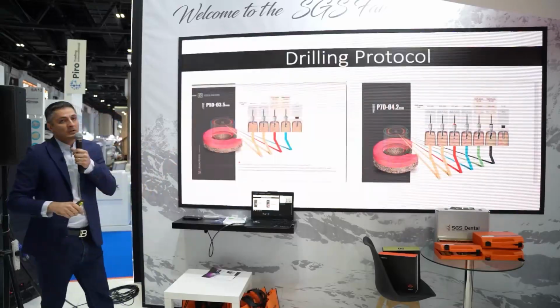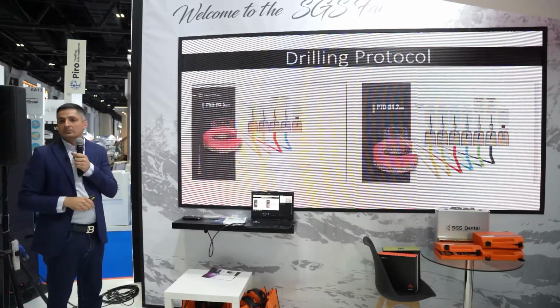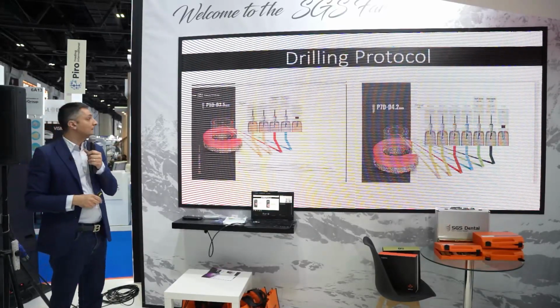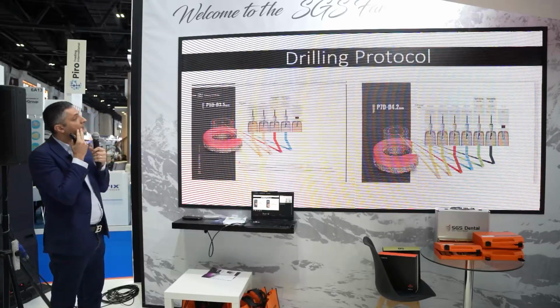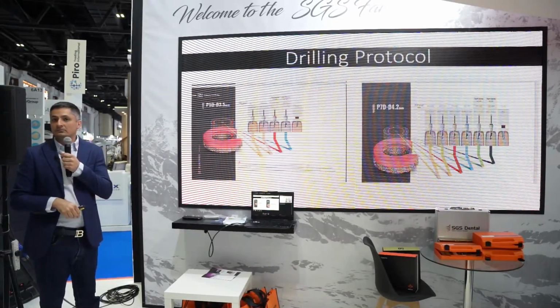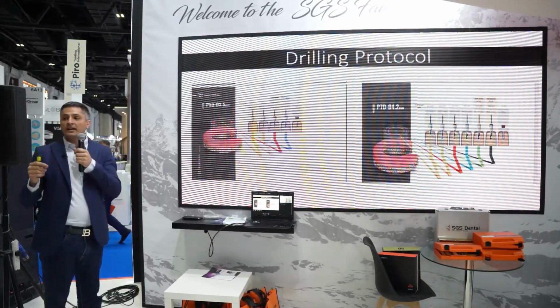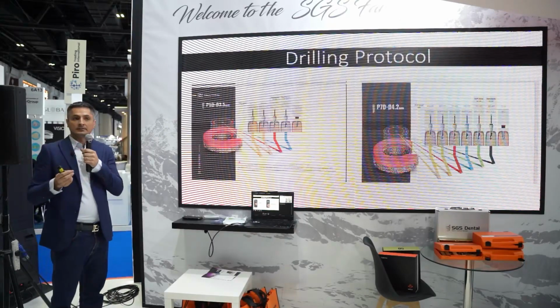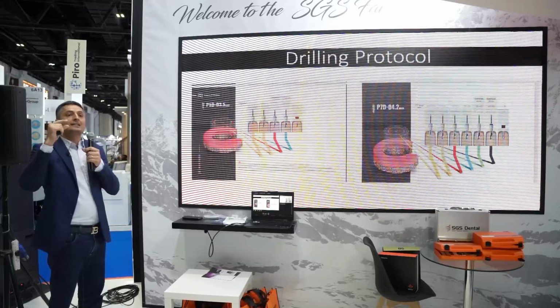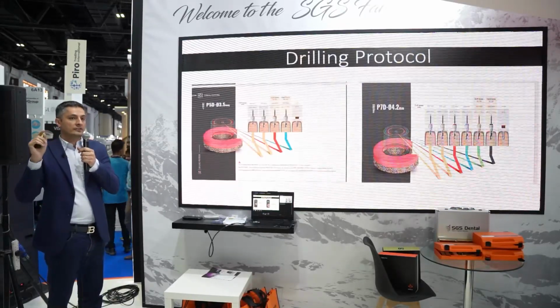This is the drilling protocol from the SGS company. I do not agree with it. Why? Let's say for the 3.5, we are putting a P5D 3.5. The last drill for the hard bone is 3.2. Never do this. Do the full 3.2 drill and then we have to use something called the cortical drill, in the maxilla and mandible. This is crazy for the maxilla, but believe me, you will have a good result.